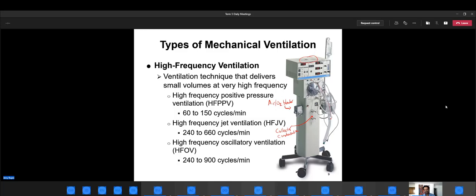Mostly it's the piston. This is how you're going to control the piston. And you can't see the piston. If you took this off and pulled that little black diaphragm away, on the other side of that is where the piston is going to be. And this knob is how you're going to get it to center, as they say. If the piston is off center for whatever reason, the machine is not going to run at all.